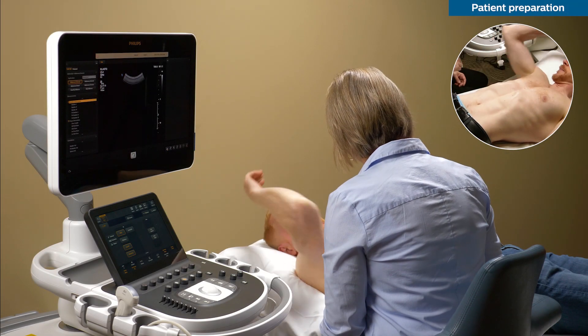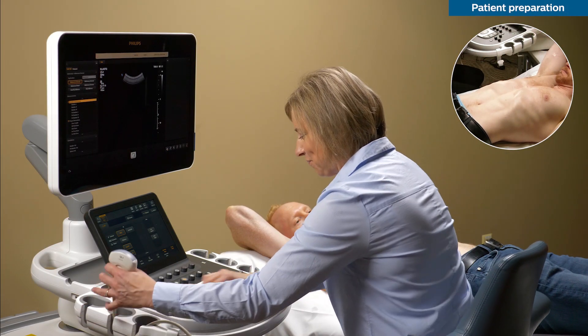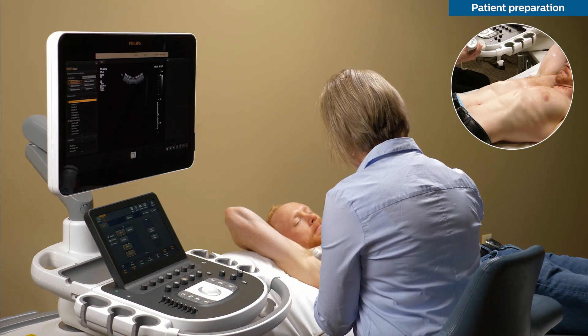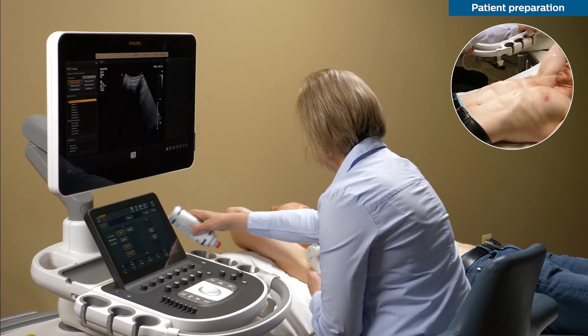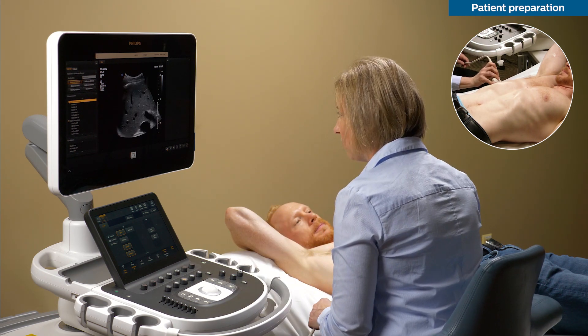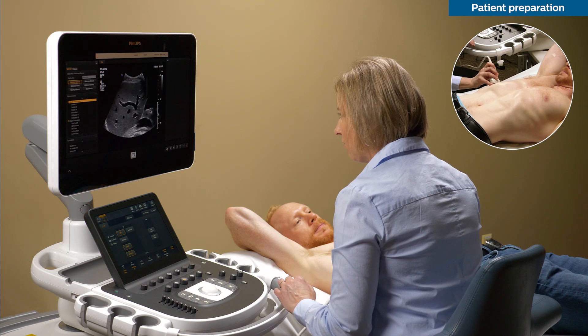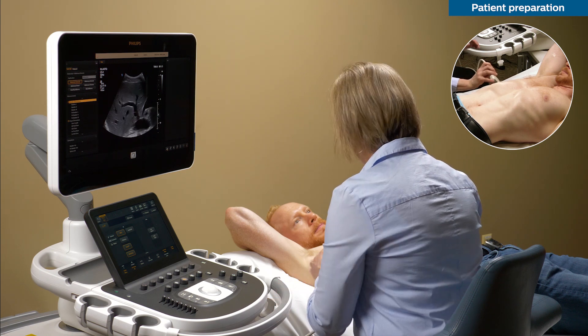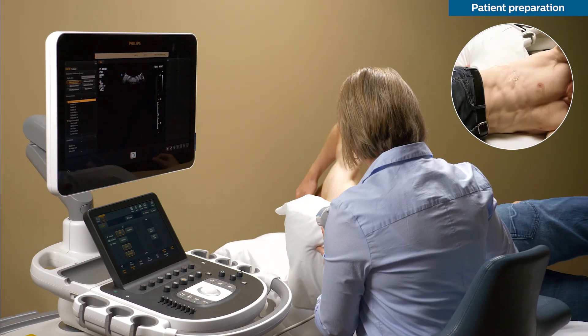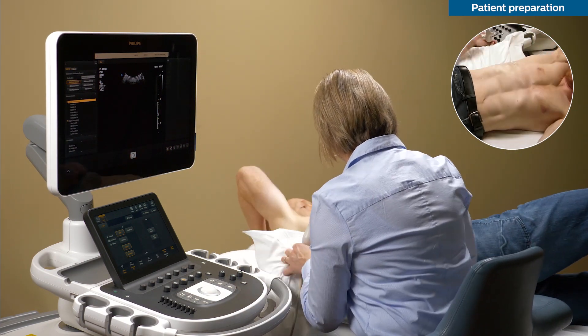The first step is all about patient preparation. Please make sure that the patient has been fasting for at least six hours. Then position the patient to increase the rib space and provide an optimal window of acquisition. A supine or left lateral oblique position with the right arm in maximal extension is recommended.